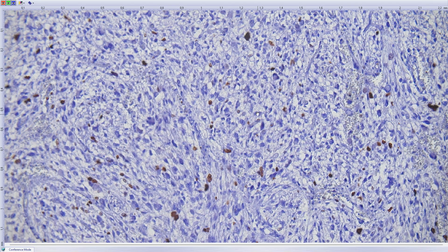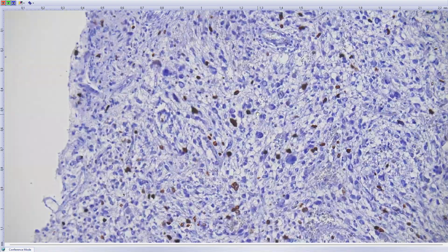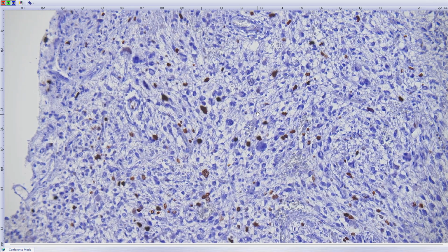These tumors behave much more aggressively compared to prototypical pilocytic astrocytomas. Most pilocytic astrocytomas retain their grade 1 for many, many years. They do not grow or grow very slowly or grow until some age of the patient.